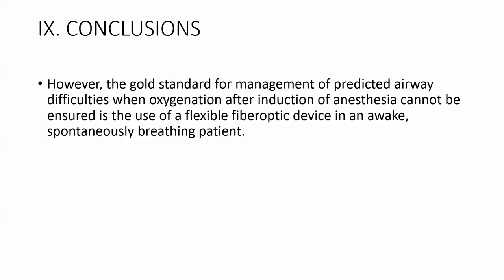It's unfortunate that if a learner becomes very dependent on video laryngoscopes, they may not develop the skills of a consultant anesthesiologist who can manage a difficult airway in the absence of the modern technology.